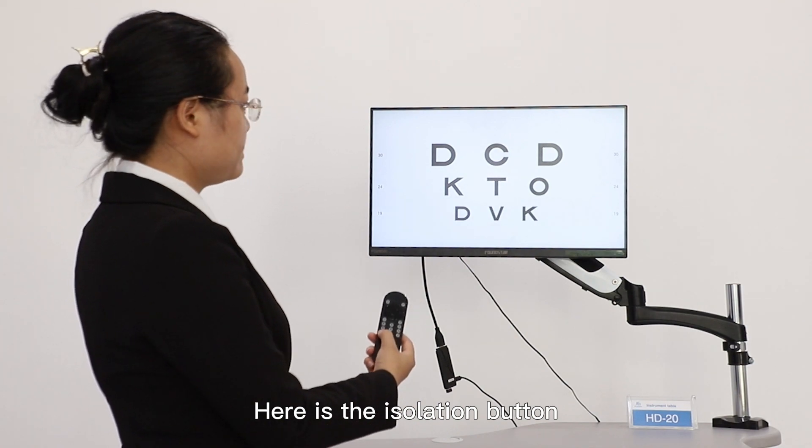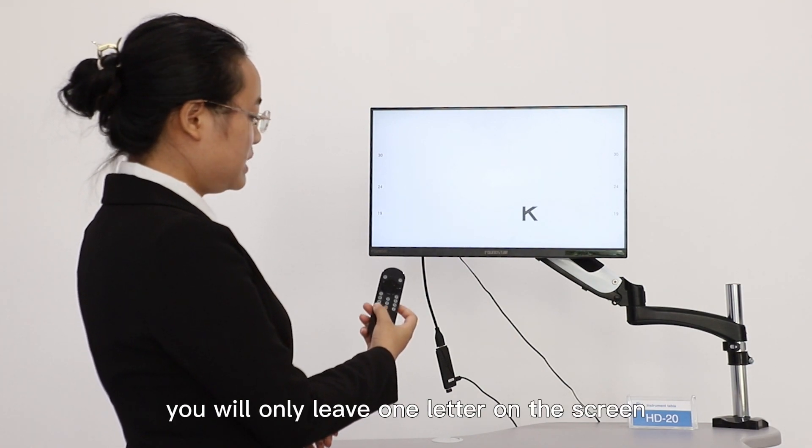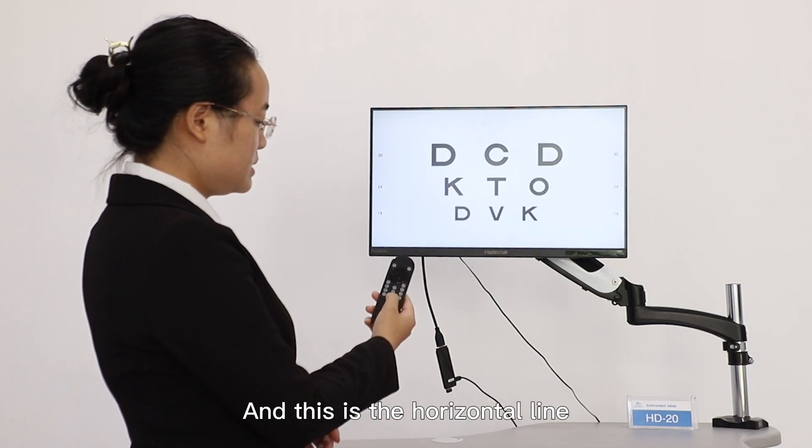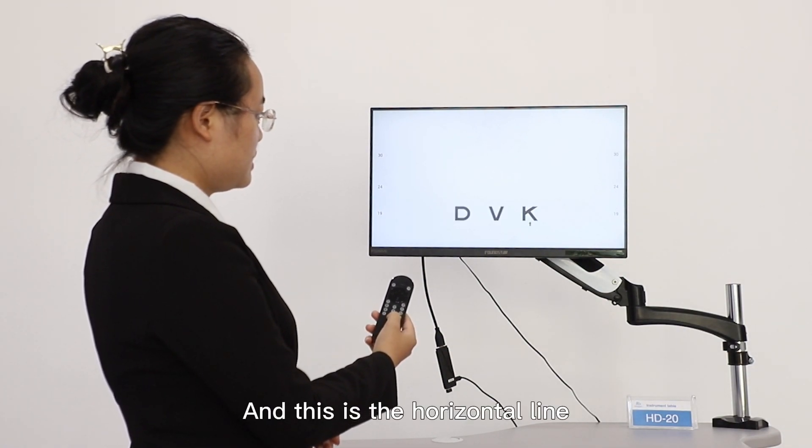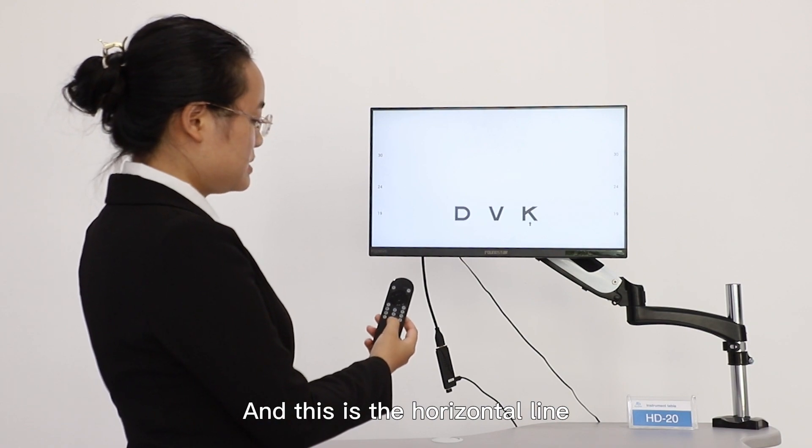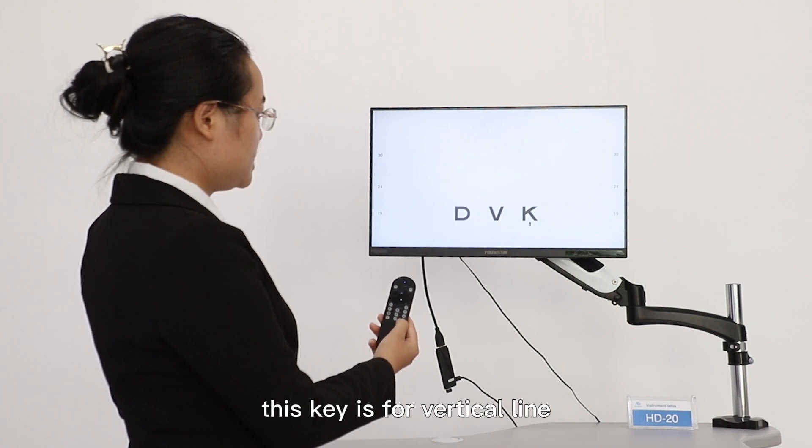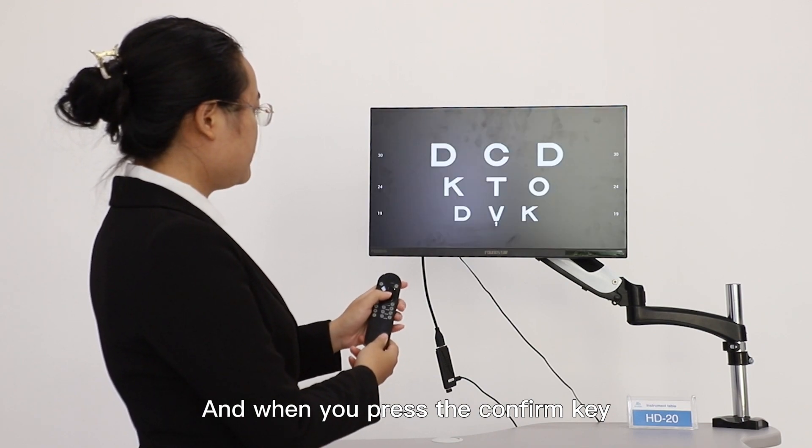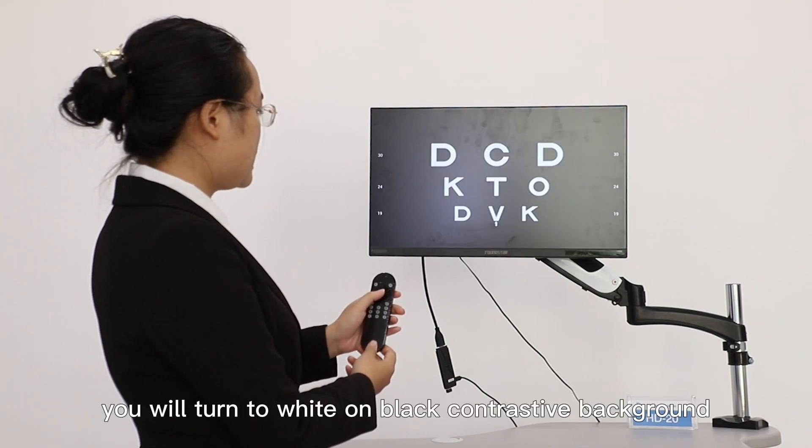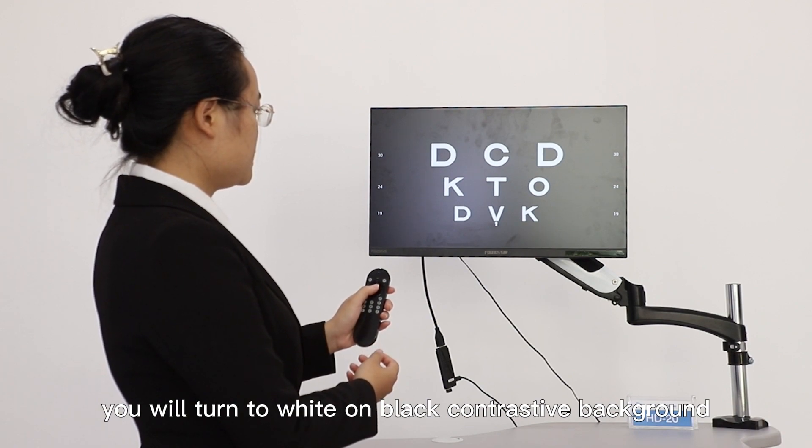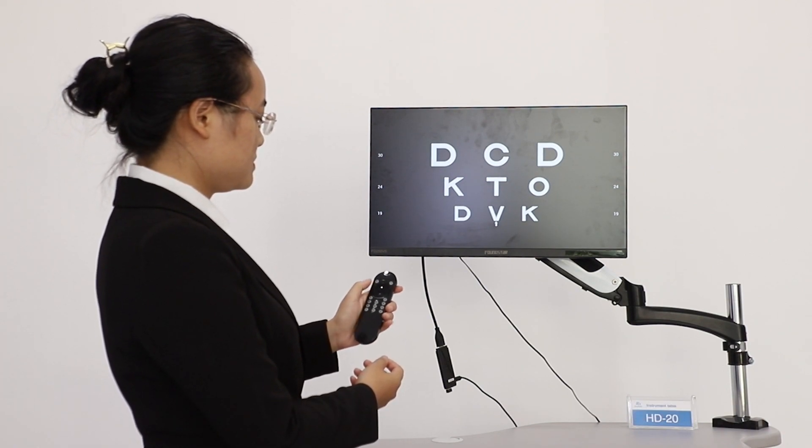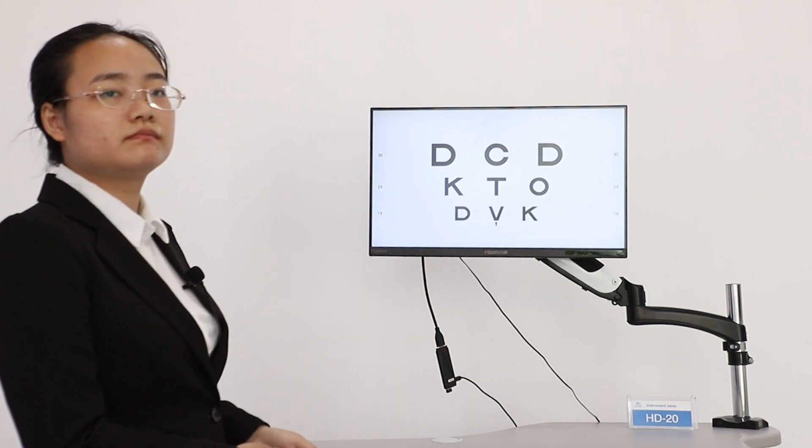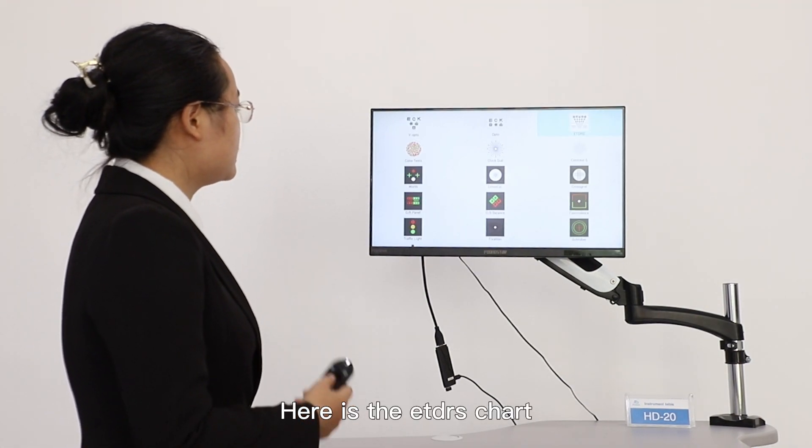Here is the isolation button. You will only have one letter left on the screen. And this is the horizontal line. This key is for vertical line. And when you press the confirm key, you will turn to white on black contrast background. And you push again, you will go back. Here is the ETDRS chart.